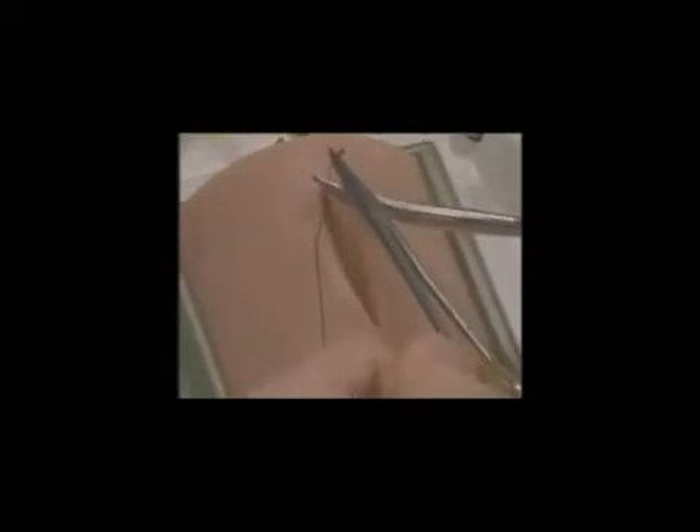The knot is tied and the free end is cut short, typically right on the knot. The needle is reloaded backhand, brought underneath the knot, and back up through the dermis at the very apex of the wound.